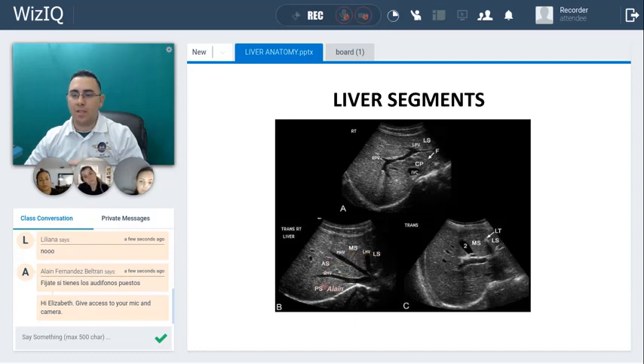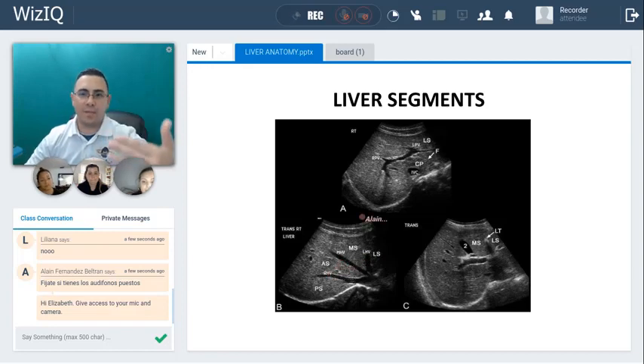These are the three hepatic veins, the same that you saw before in the other picture. Since this is a transverse view, it makes sense: this will be anterior-posterior, this will be right, and this will be left.